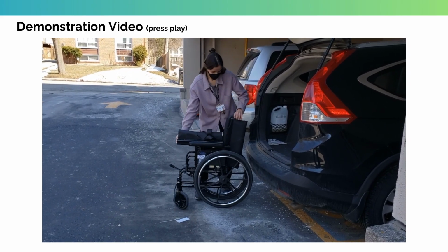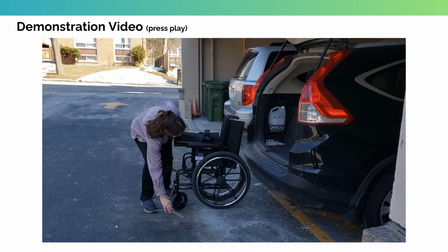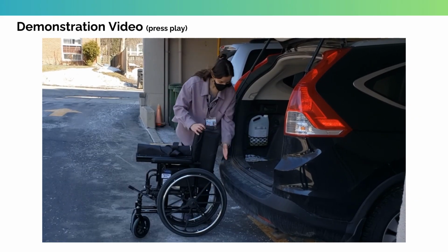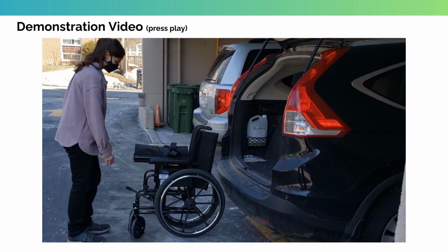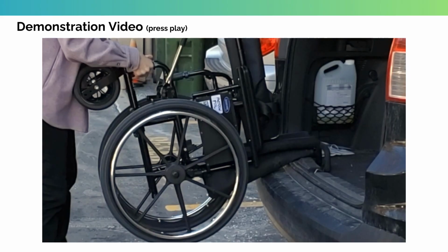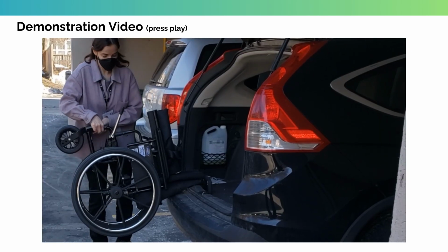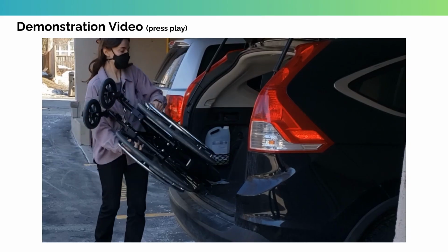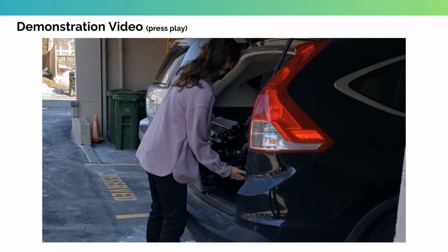Ensure the brakes are on so the wheels do not spin around, and then back up the chair so the backrest is as close as possible to the trunk. Bending at the knees and keeping your back straight, lift the front of the wheelchair by holding on to a non-moving part and tilt it back onto the trunk. Finally, hold on to each wheel and swing the chair into the car, keeping it close to your body to avoid excess bending.